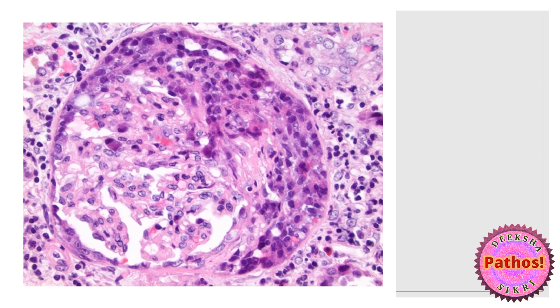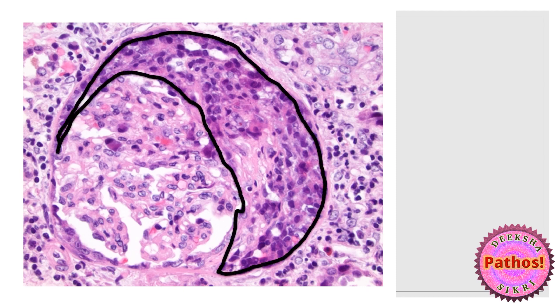Normal then abnormal — now this is very interesting. If you notice carefully, something seems to have come between the Bowman's capsule and the capillaries of the glomerulus. The structure I've highlighted has a roughly crescent shape — I'll show it to you again. You can make out a crescent-shaped structure on light microscopy.